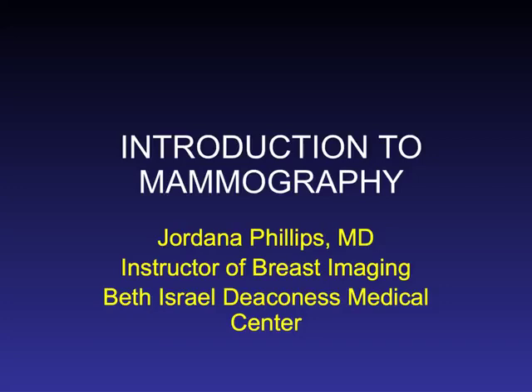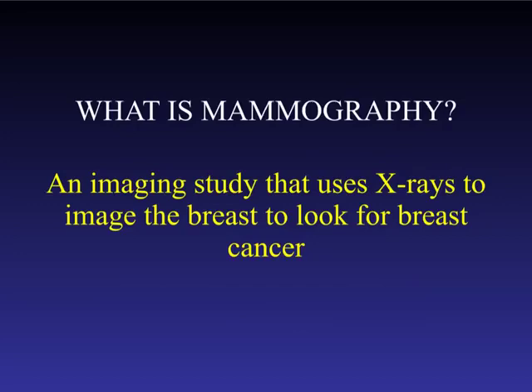This video is an introduction to the basics of mammography. First, we will discuss what is mammography. A mammogram is an imaging study that uses X-rays to evaluate the breast for breast cancer.